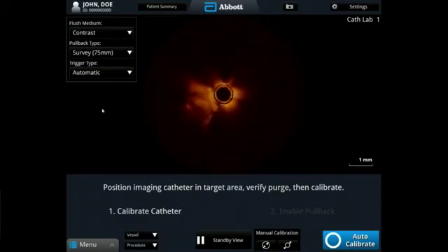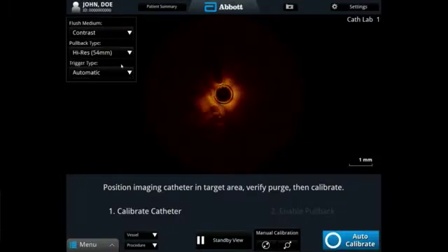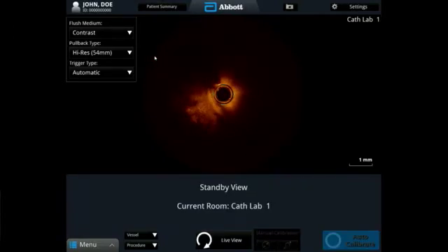Just show the live flow for a second. Can you change the pullback type to high res? The catheter is past all of it now. Now all of a sudden you're able. Which one do you want? The pullback, high res, please. Good. So now remember, you can use your guideline if you want to make sure you got really good opacification. Yeah, I think we're good.